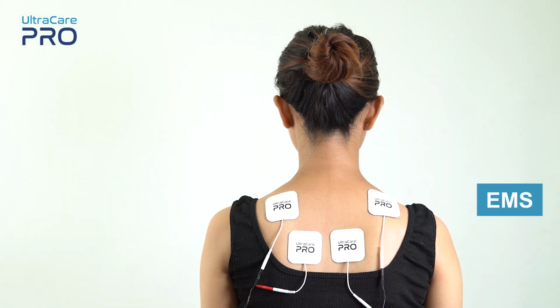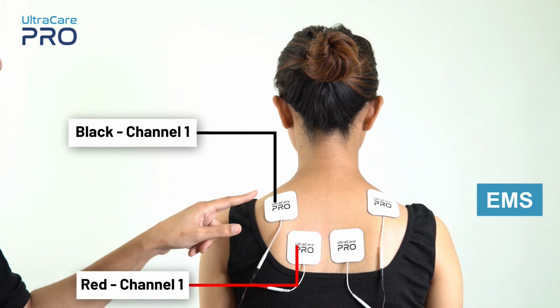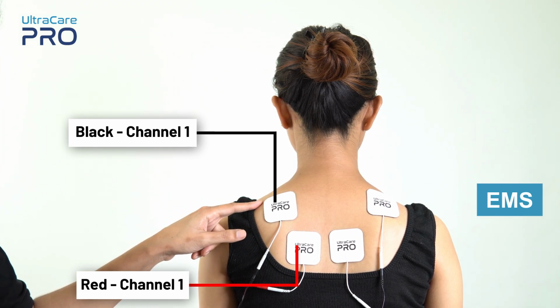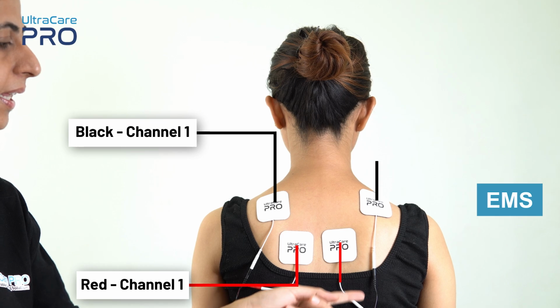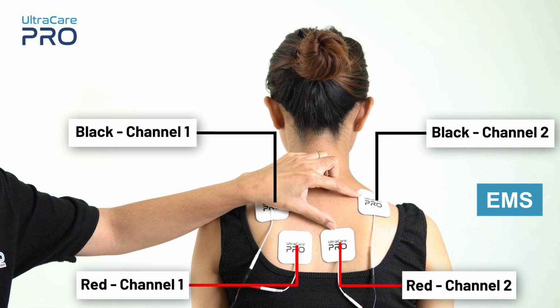For EMS application, place black and red wire from channel 1 on the muscle on the left side that needs to be stimulated. Similarly, the red and black wire from channel 2 is placed on the right hand side over the muscle that needs to be stimulated.